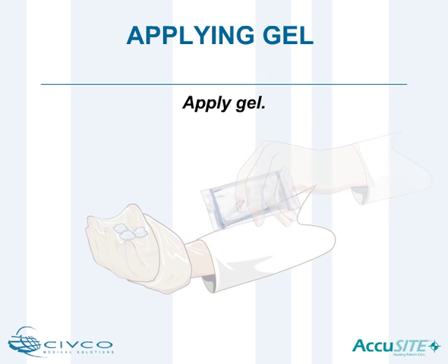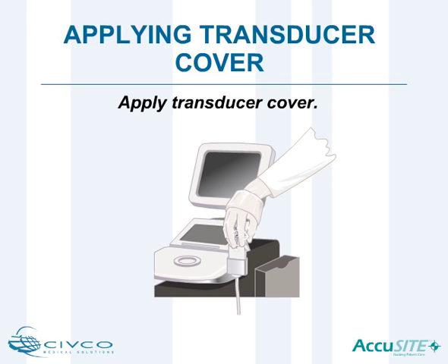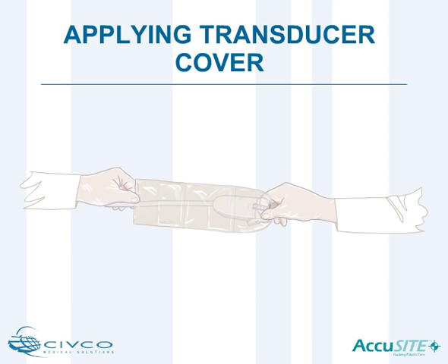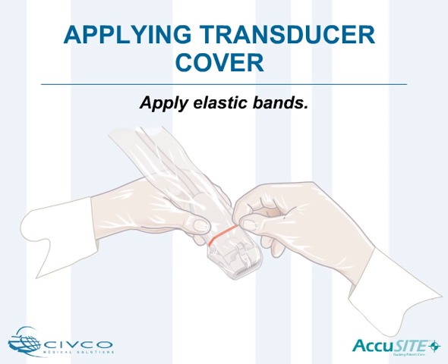Apply gel to the inside of the transducer cover or directly on the transducer face, applying enough gel to entirely cover the face of the transducer. Practicing proper sterile technique, place the non-sterile transducer into the gelled cover. Sterile, gloved hands will then carefully pull the cover down over the transducer and cord. Apply the colored elastic bands to secure the cover in place.